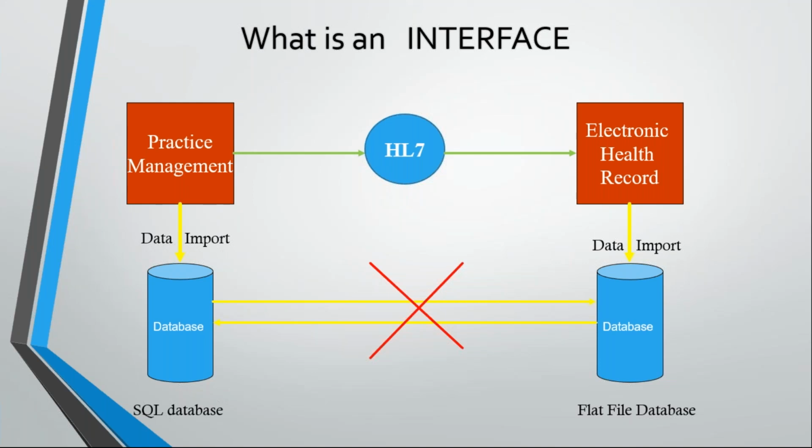One important thing to note here is that in the previous slide we saw there is a challenge for the integration engineer to understand the architecture of the database of the other side. With HL7 that has been solved. Now it doesn't matter what kind of database that application has, whether it's an SQL database or a flat file database, whatever it is. We are going to send the data in the form of HL7. It is just a direct connection between the applications, where it will extract the data from the database, convert to HL7 and send it over to the EHR system.